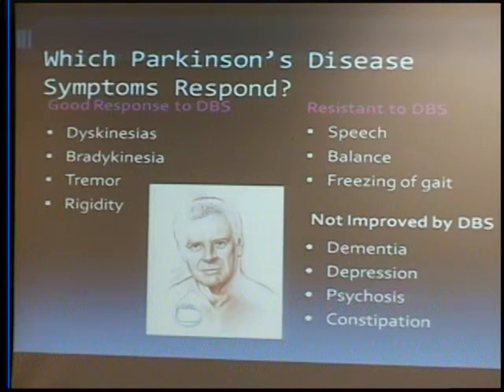And then psychosis, in this instance, they're talking about things like hallucinations and whatnot. We don't expect to make hallucinations any better. However, if people are hallucinating because of the amount of Parkinson's medicine they have to take to be able to move around, after surgery, if we can lessen the medicines, I have had instances where we can improve the hallucinations. But again, at baseline, we're not expecting we're going to make that any better.